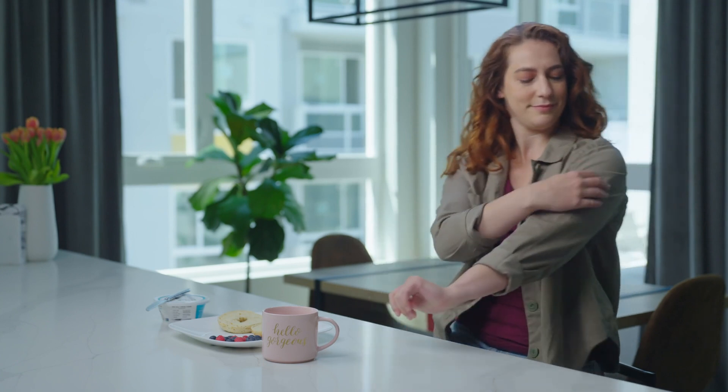A pre-meal bolus can be performed even through clothing, providing a discreet, quick, and simple process.